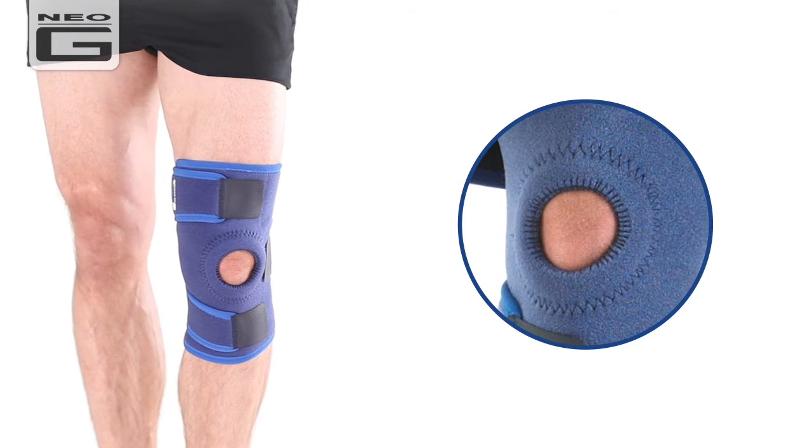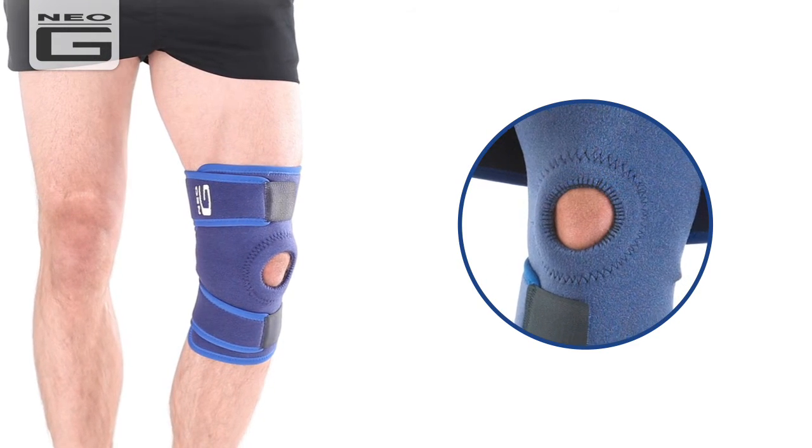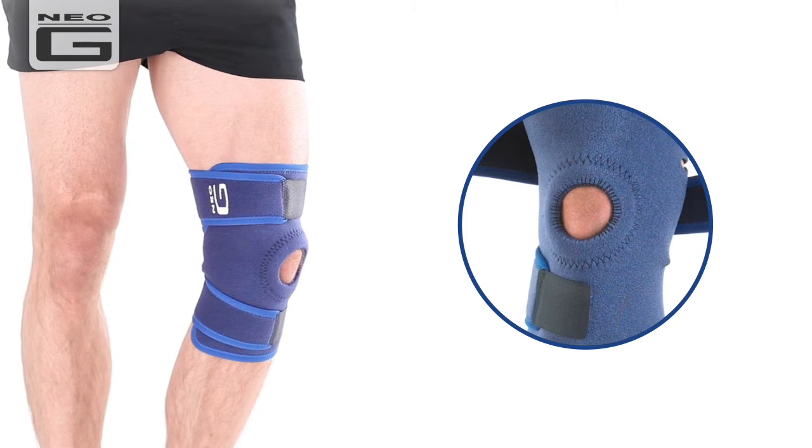The open patella design with padded buttress helps with patella tracking whilst providing added support and helping with overall stability by helping reduce glide and twisting at the knee.